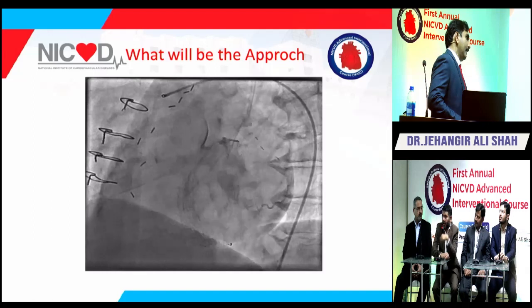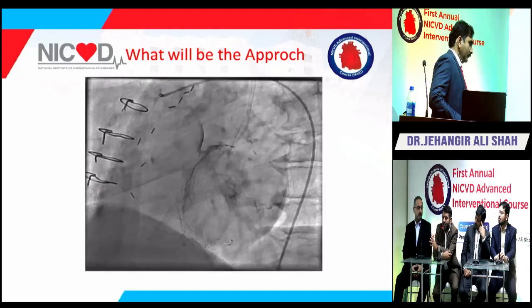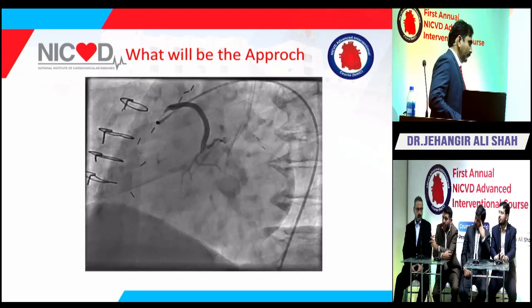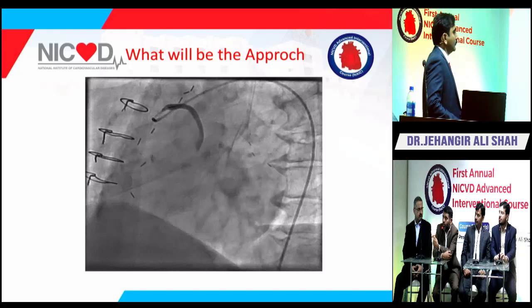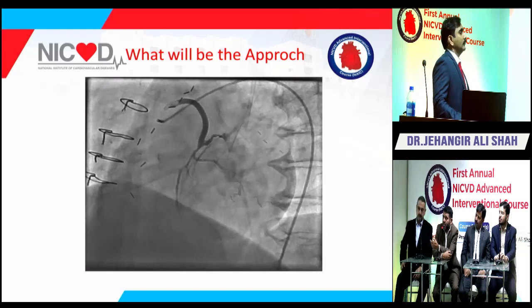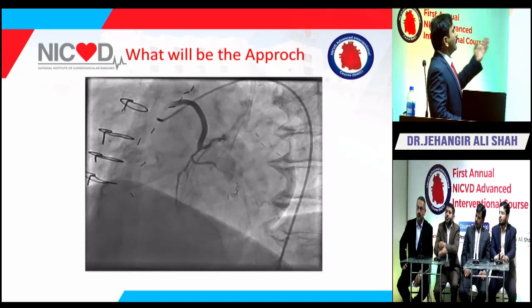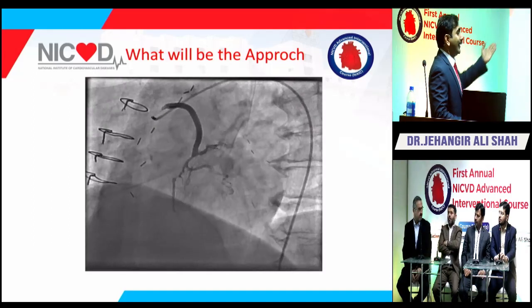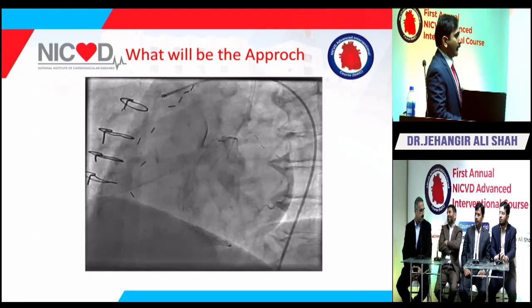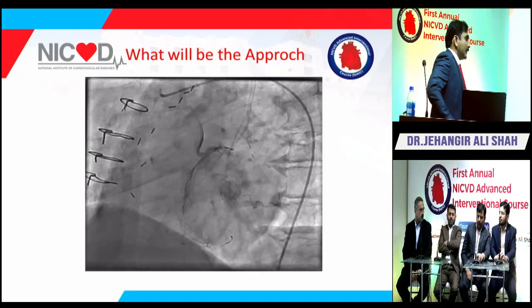This is high takeoff. The third indication of guide support is the high takeoff SVG. So I think your case is high takeoff. Maybe you will feel difficulty crossing the lesion by balloon or stent, and maybe you need a support guide. Okay, Dr. Bashir, what complication or what event can you observe while engaging the guider in this lesion, and what measures will you have to take while doing PCI?